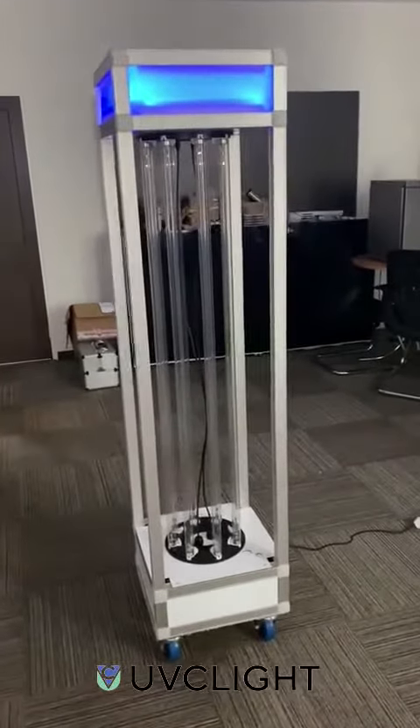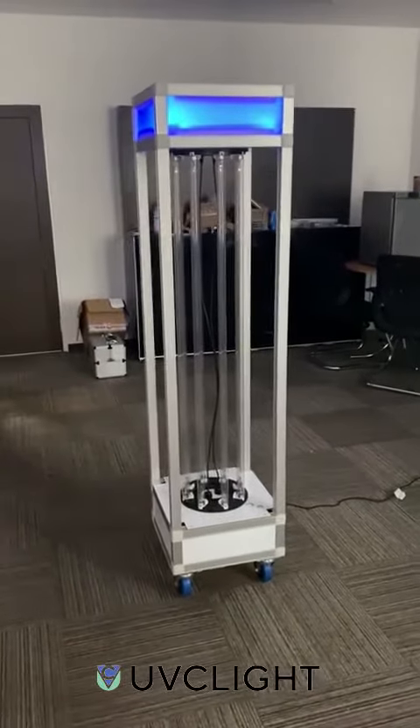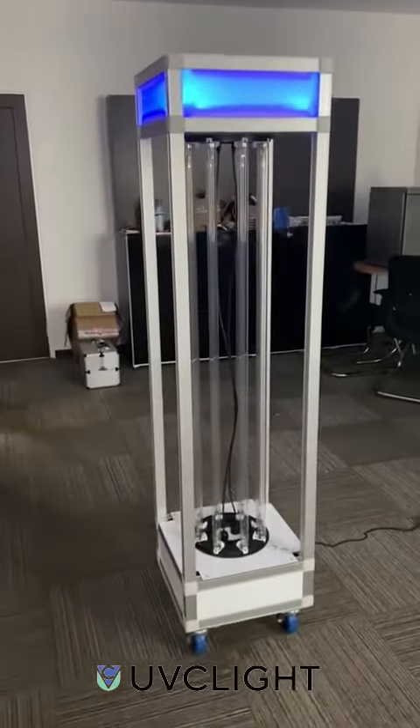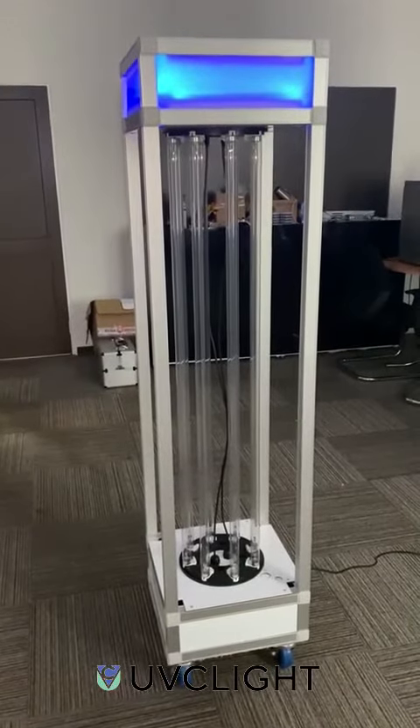Presenting the UVC disinfection trolley powered by Warranty Robotics Limited. It comes with 8 bulbs at 75 watts per bulb and it's very easy to use.